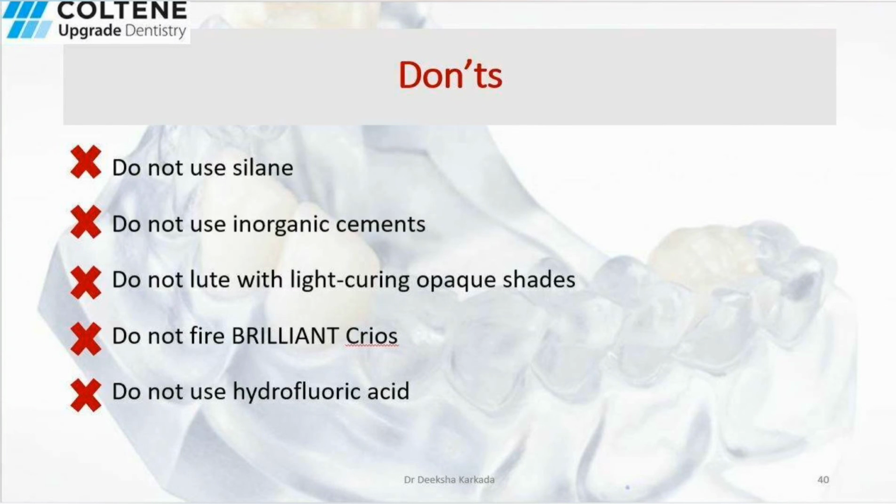Few things to be avoided is to never use silane, never use inorganic cements, never lute with light curing opaque shades. If using Brilliant Crios as the material of choice, then do not fire it, and never use hydrofluoric acid for the purpose of etching.